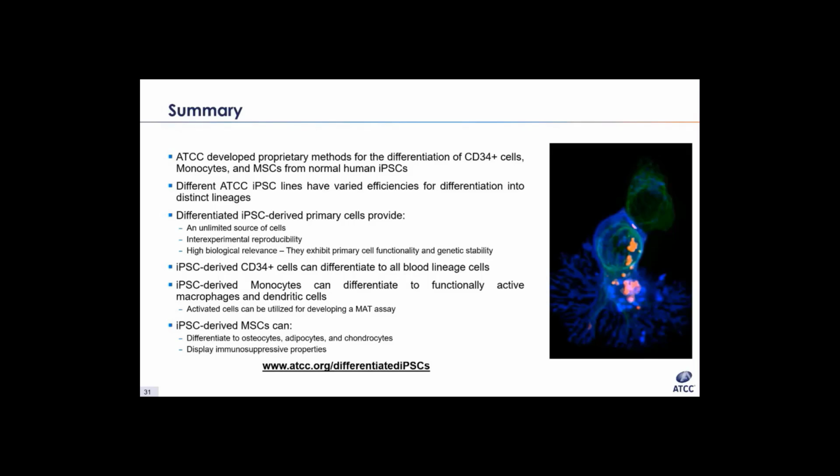All right, and it looks like the next batch of questions that we have coming in is around culturing the iPSC-derived mesenchymal stem cells. So the first question that we have is, what is the seeding density for the ACS 7010 MSCs? So we'd recommend seeding those cells at 10,000 to 20,000 cells per centimeter squared post-thaw and post-culture.